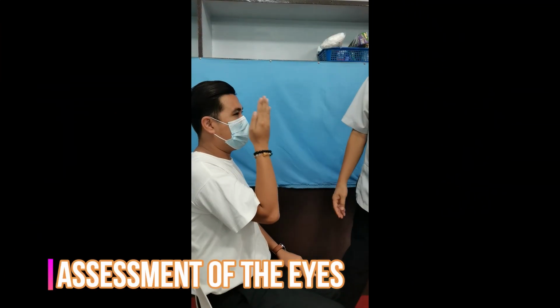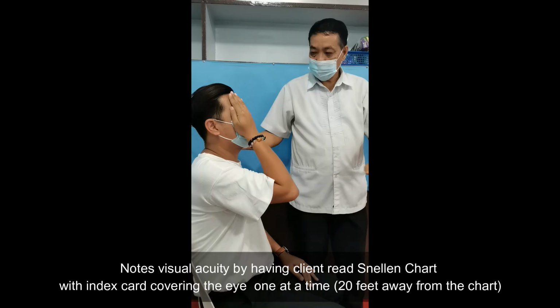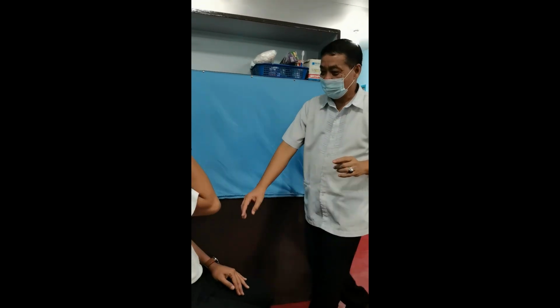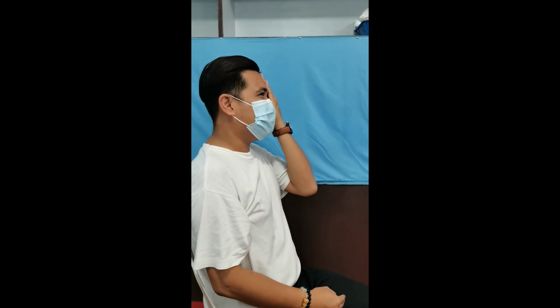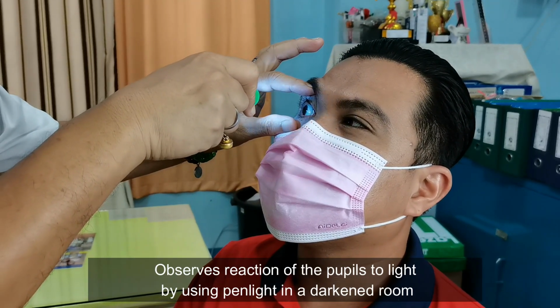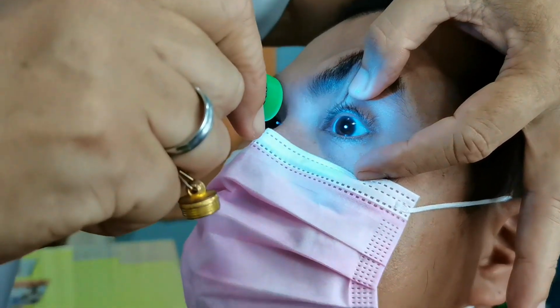Notes visual acuity by having client read Snellen chart with index card covering the eye one at a time. This is 20 feet away from the chart. Observes reaction of the pupil to light by using pen light in a darkened room. Inspects the eye for any inflammation, conjunctivitis, eye movement, appearance of eyebrows and globes protrusion. Inspects iris color.